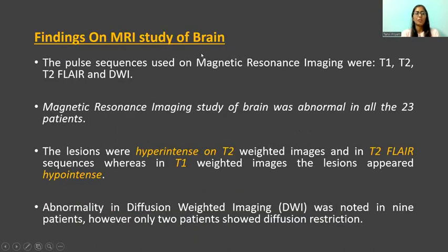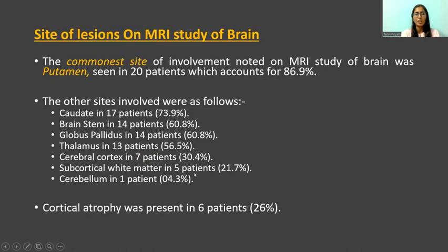MRI study of brain was abnormal in all 23 patients. The lesions were hyperintense on T2-weighted images and T2 FLAIR sequences, whereas on T1-weighted images the lesions appeared hypointense. The commonest site of involvement noted on MRI was the putamen, seen in 20 patients. Other sites involved were the caudate region, brain stem, globus pallidus, thalamus, cerebral cortex, and subcortical white matter.